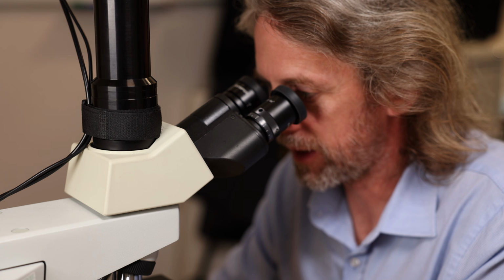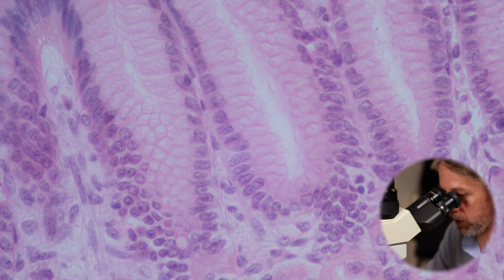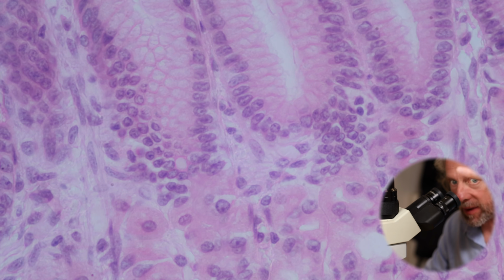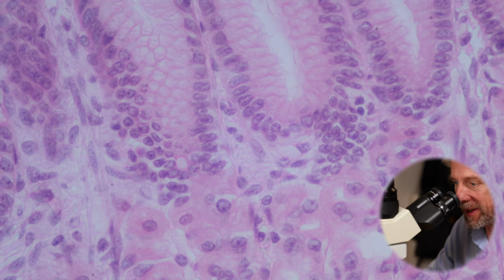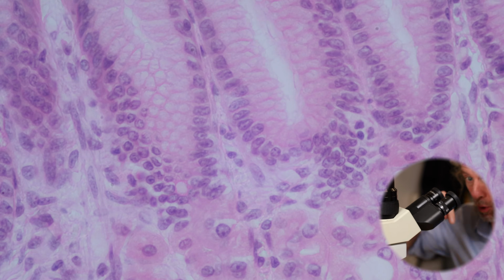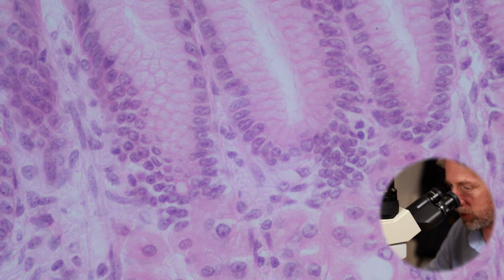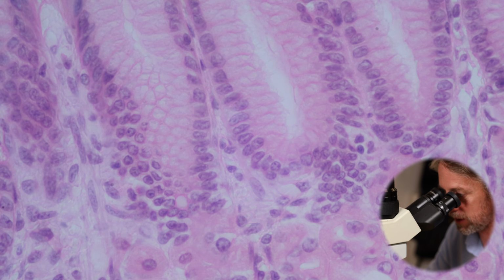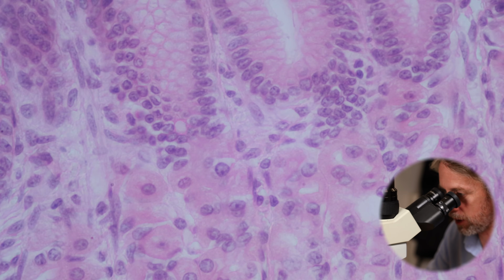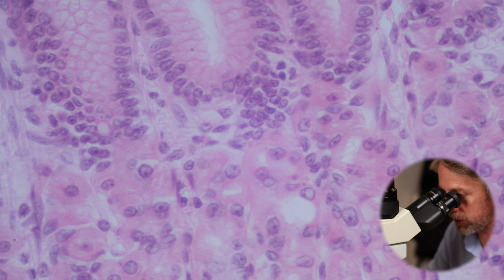So as you go down the gastric pit, if we had the perfect section, we could follow that down and see that central tube probably splitting into 2 or 3 different directions. And that's why we lose it, because it's not continuing in that direction, it's going off into different planes, in different directions. But those surface mucus cells become neck mucus cells as we go down.